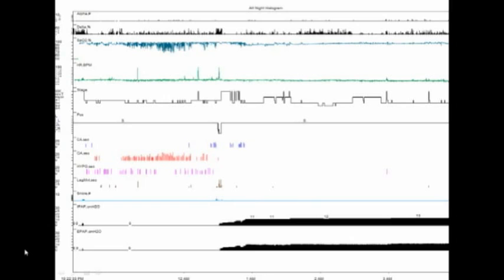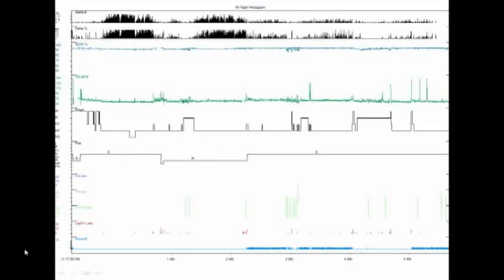Now, if we look at the top two lines, we see an alpha intrusion line and a delta line. We see that the person is getting some delta sleep, which is good because we like to have delta sleep. But the top line is flat. What's interesting about this is that this is a patient who has very severe obstructive sleep apnea. They're having significant heart rate variability. They're having oxygen desaturation. Yet even as clinically disturbed as this person's sleep is, there's absolutely no alpha wave intrusion. Let's compare it to the next slide of someone with fibromyalgia.